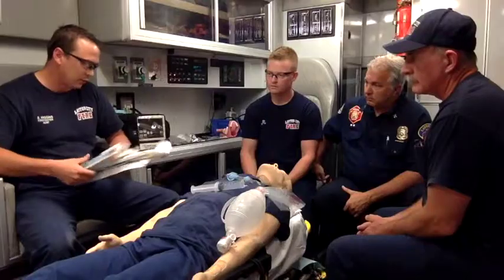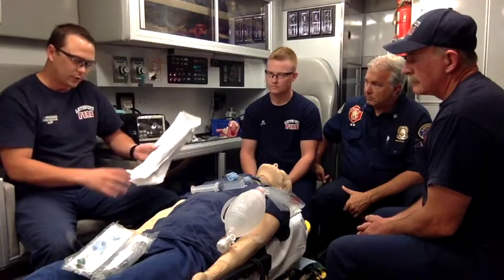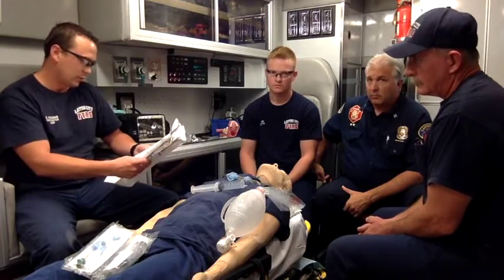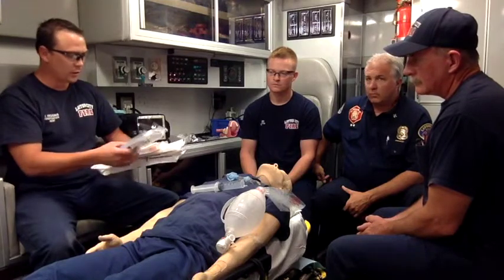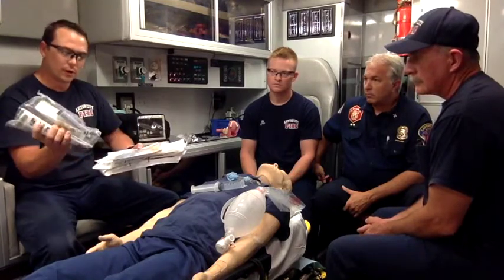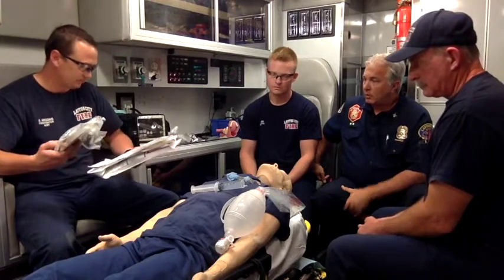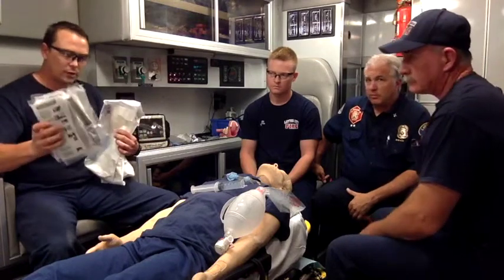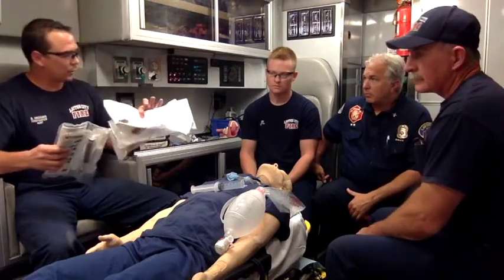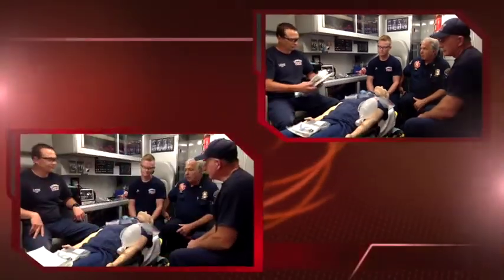They also have what you should inflate them to listed down here. These three seem to be the same, and these are a little less. And these actually come with the correct size syringe, so it's a little easier to find that size. The other ones don't come with the syringe, these do not. We used to only have these ones, and now we're carrying these. I think it's a little different than in the past.